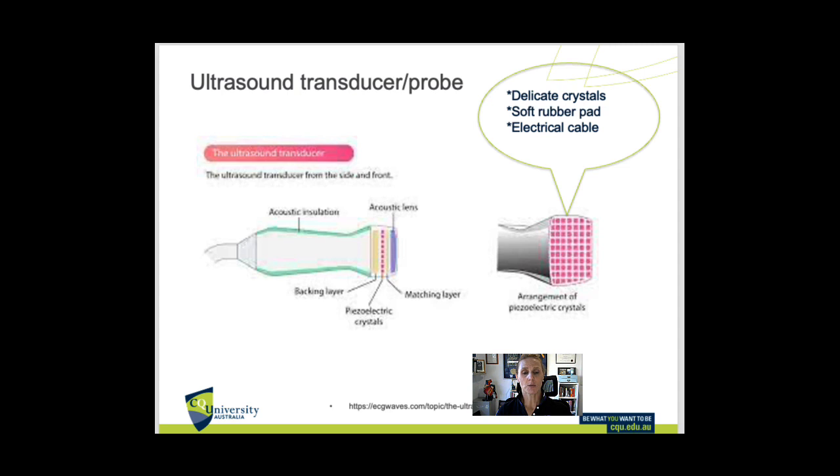The transducers or probes themselves are quite delicate and hold a fair amount of crystals in the end of the probe. We don't want to drop these. The machines do have cradles on the sides for their transducers, and hooks on the sides of the machine for cables, so there's no potential hazard of cables getting under the wheels or in the brakes, causing us to trip or causing breakage.